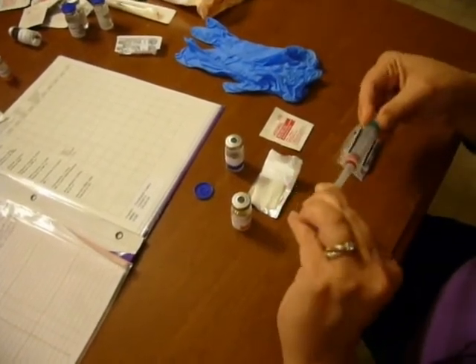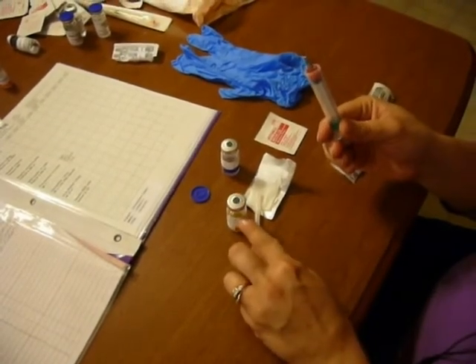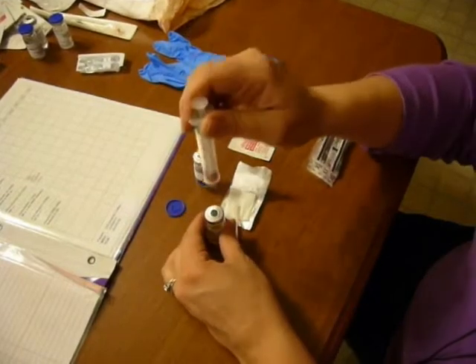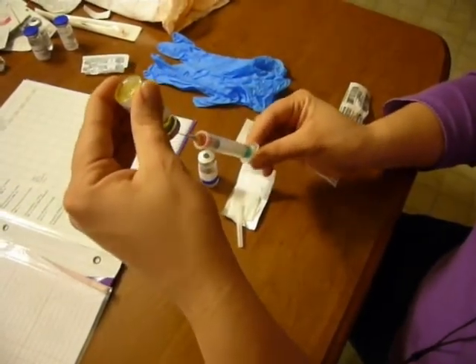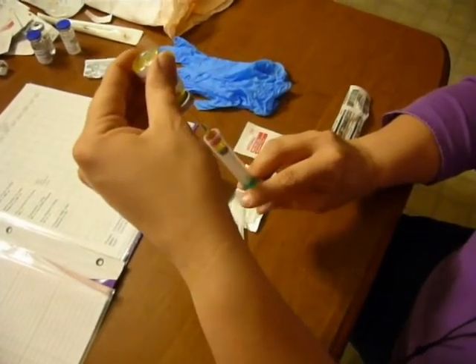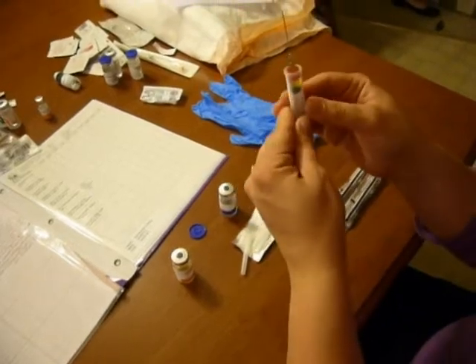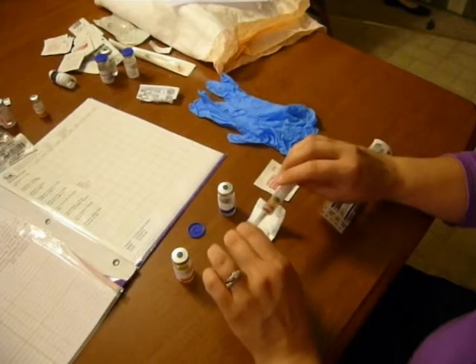I take off my needle cover again and set it down on the sterile field. Now this is already pressurized because I added solution to it, so I don't need to add air. If you accidentally did, that would be fine if you added the 0.5 cc's, but you do not have to. I insert my needle, flip it over, and draw the 0.5 mLs that I need to get the exact dose. I readjust for any air bubbles — there are none. Cover the needle and make sure you keep sterile.